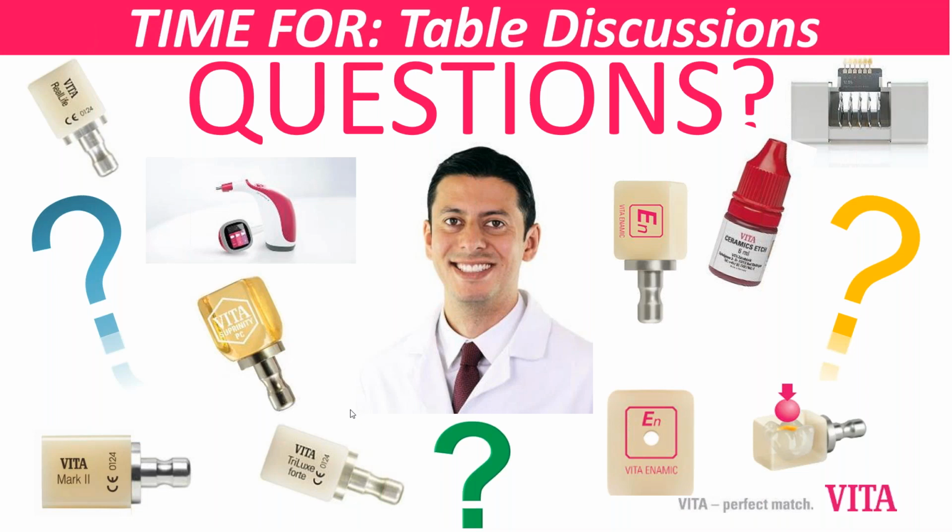And here maybe Jim, you can help me with this one. I just like how it looks. It looks like a natural tooth. It doesn't look over glossy. Right, and that's what it's for, an alternative to give you more of a natural matte finish that's more resembling a natural tooth gloss.